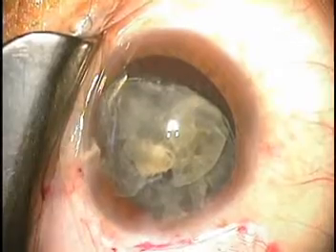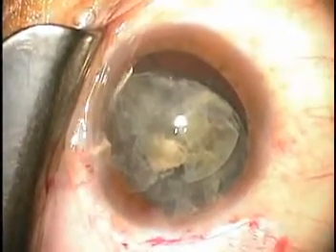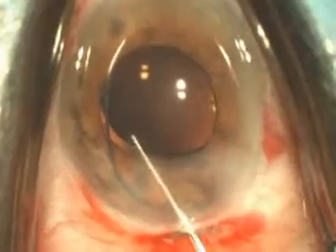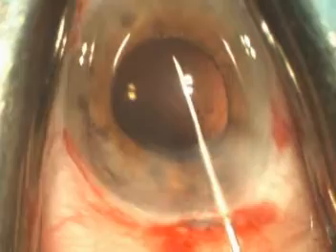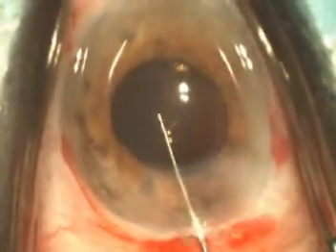This causes some problems during cataract surgery. For example, a surgeon may miss cortical remnants at the lens equatorial region, and the extent of zonular damage cannot be judged when a zonule ruptures. In some cases, the surgeon is uncertain whether or not an intraocular lens is positioned as intended.